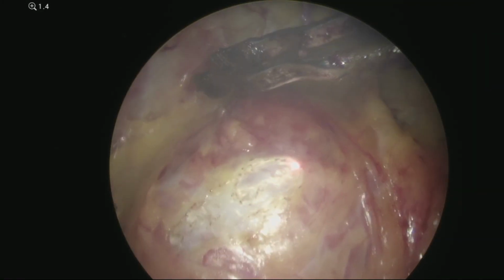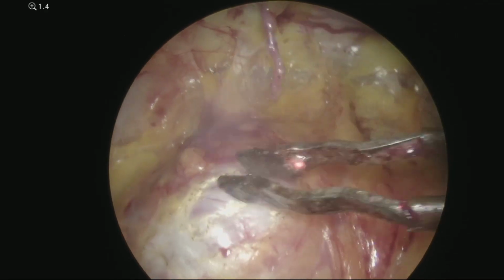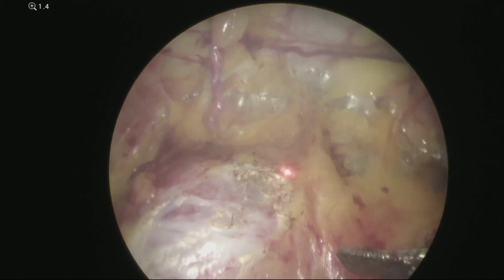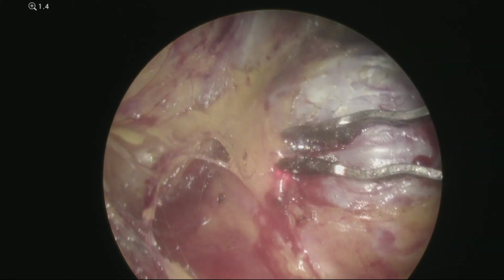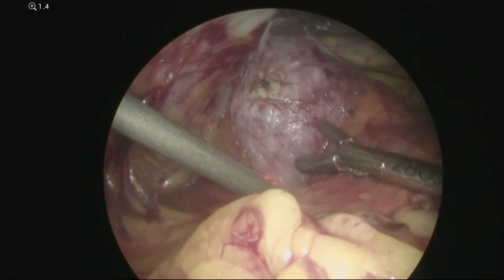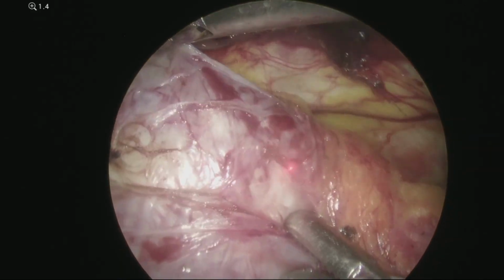The mass was subsequently dissected out of the underlying tissue using a combination of carbon dioxide laser dissection and bipolar cautery. Hemostasis was assured within the defect. Cystosufflation was once again performed in order to both delineate the outline of the bladder as well as ensure that there were no defects within the bladder. The bladder was found to be intact.